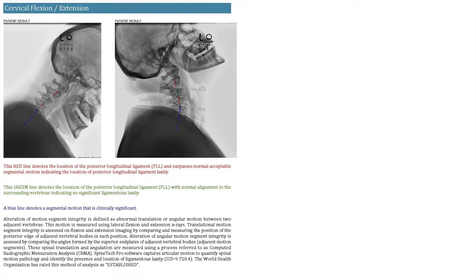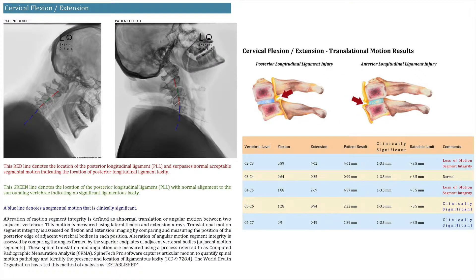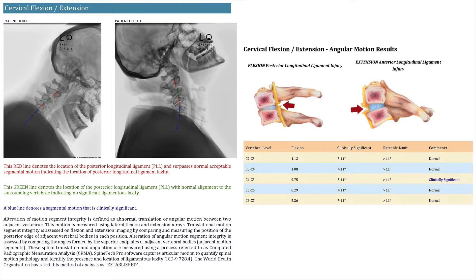What you're going to get with this analysis is flexion extension translational motion results, showing the measurement in flexion, the measurement in extension, the total patient result, clinically significant range, rateable limits, and the patient's rating. You're also going to be able to check their angular motion in degrees. If the angular motion is normal, it appears as normal; in red if it's rateable, and in blue if it's clinically significant.